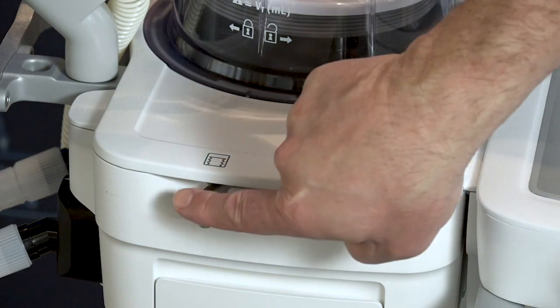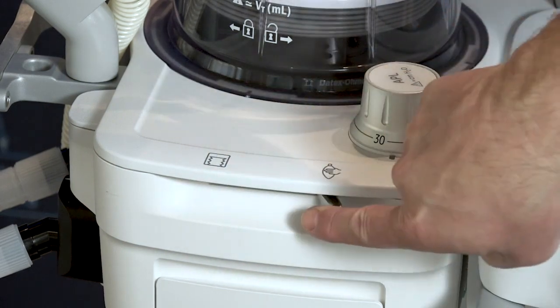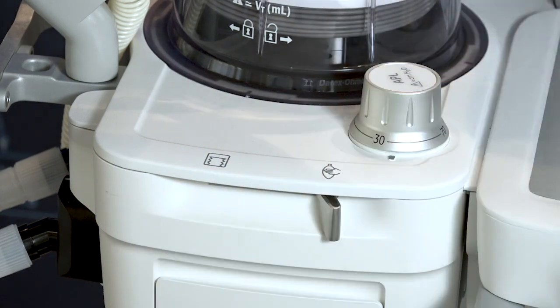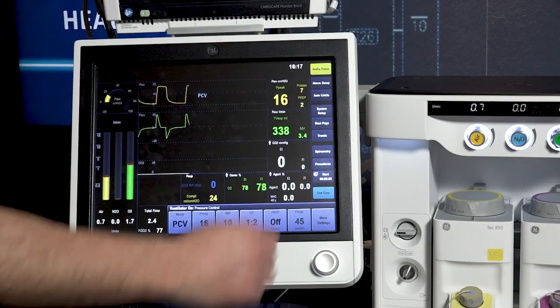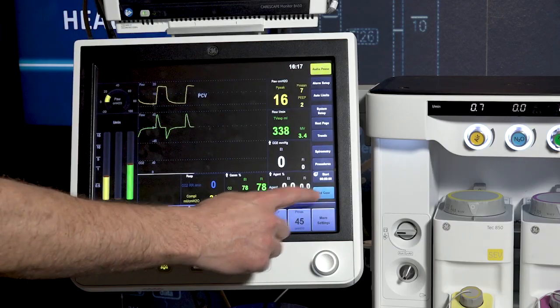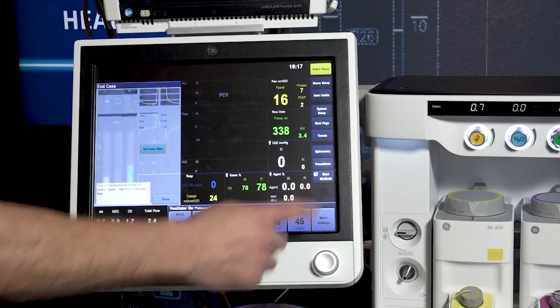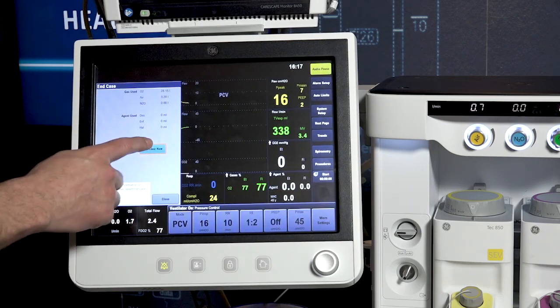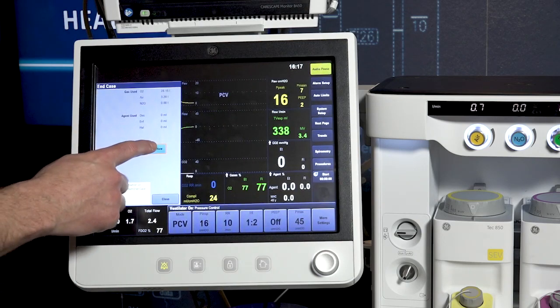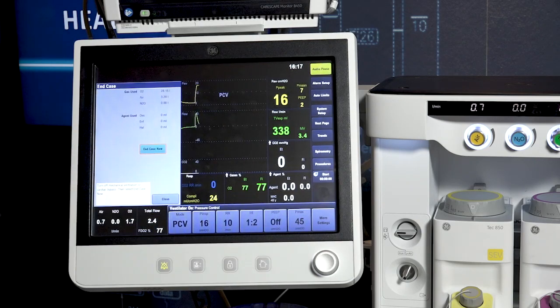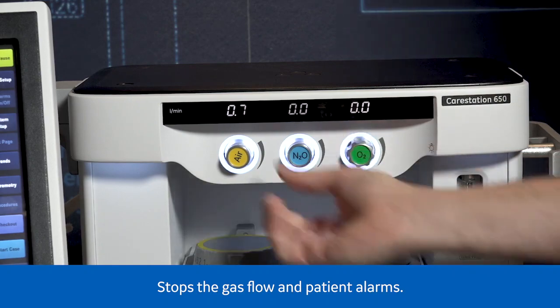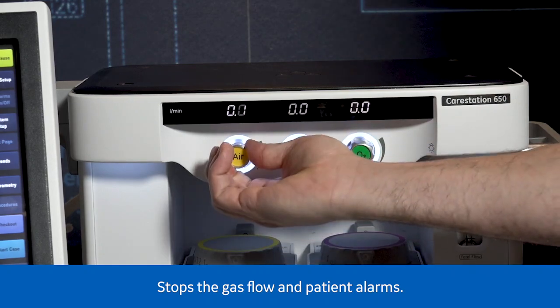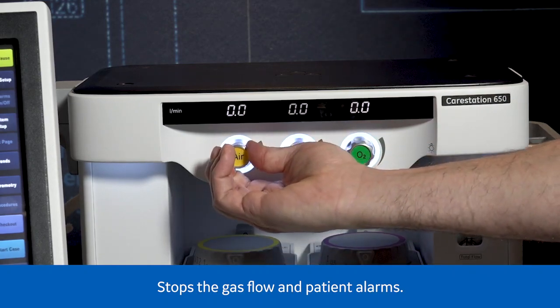To end the case, set the bag to vent switch to bag and select end case. Select end case now on the menu to put the system in standby. Turn off your air and oxygen flows.